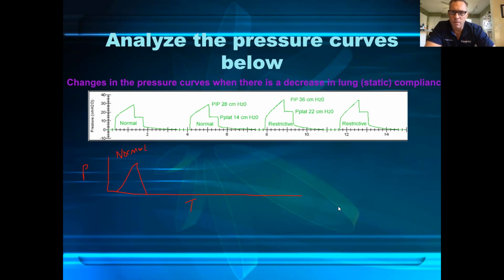But also on non-vented patients, isn't that the case? Like in normal breathing, for any one of us, before you get to peak inspiratory, it kind of levels off a little bit before falling back down again. It's not like a shark fin. Is that right or wrong? Maybe you can draw it for me when you come for lab.